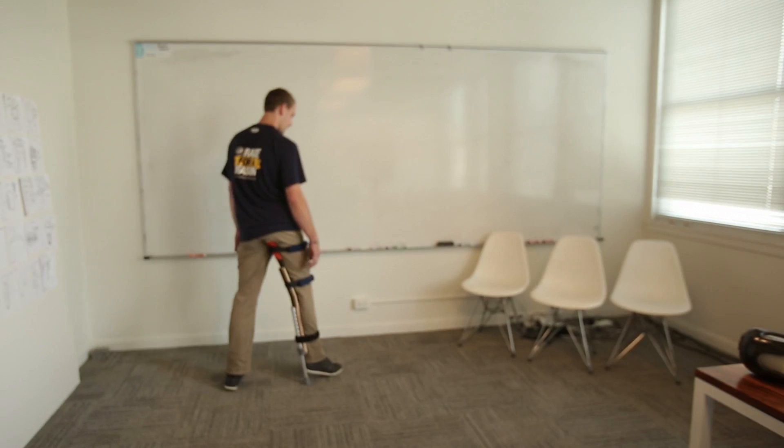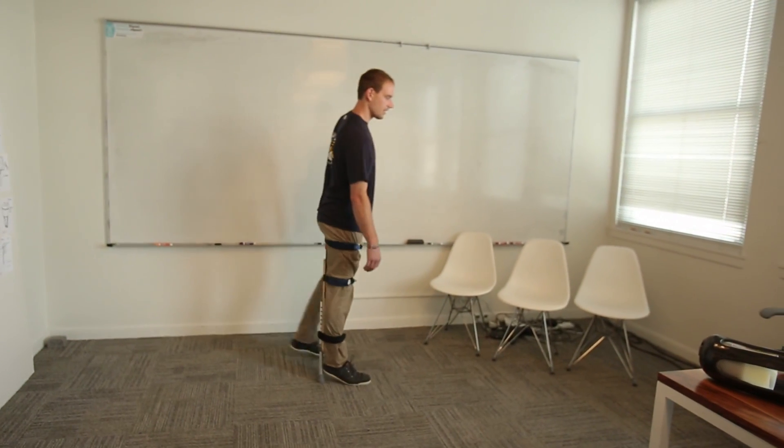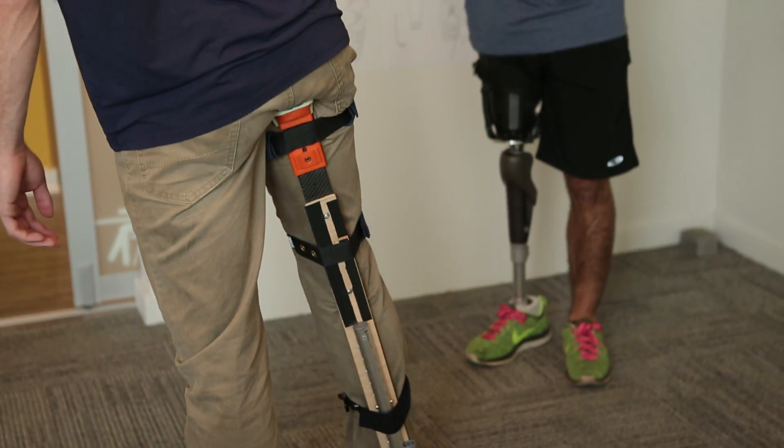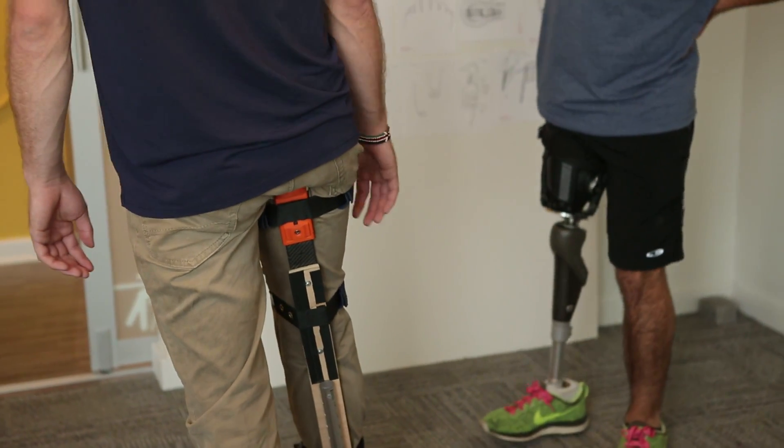We've created a rig where we can interchange the seat parts very quickly and understand what feels more comfortable, what's giving support, what's giving control.